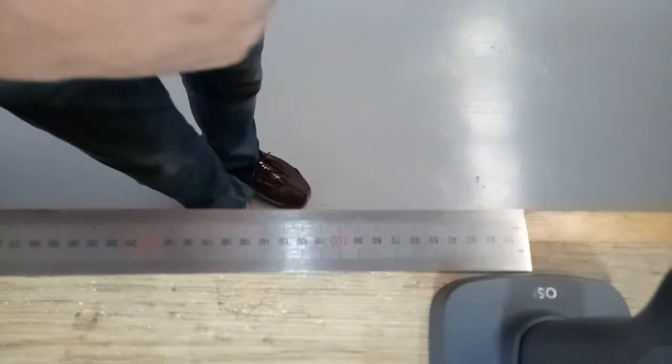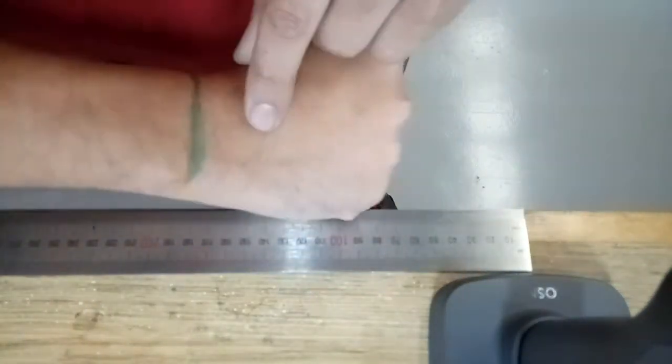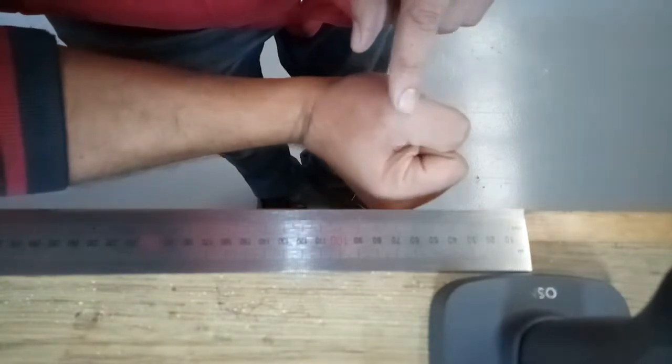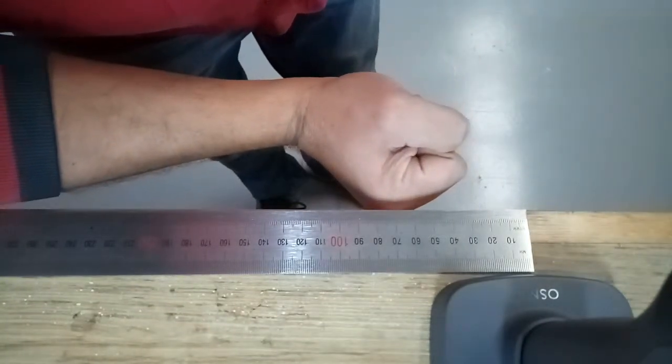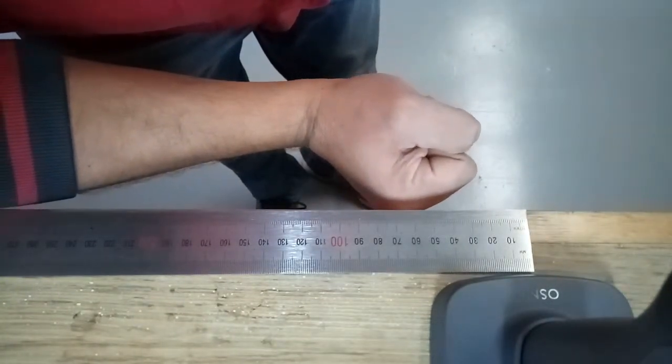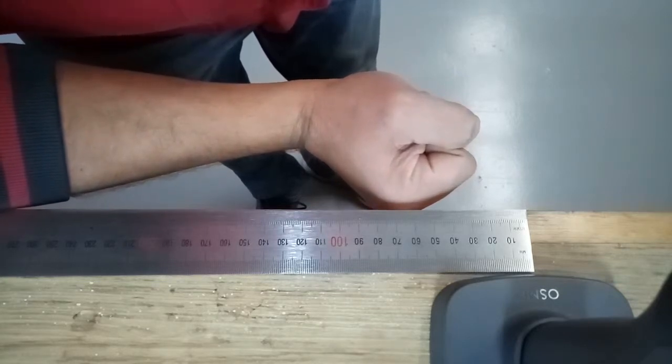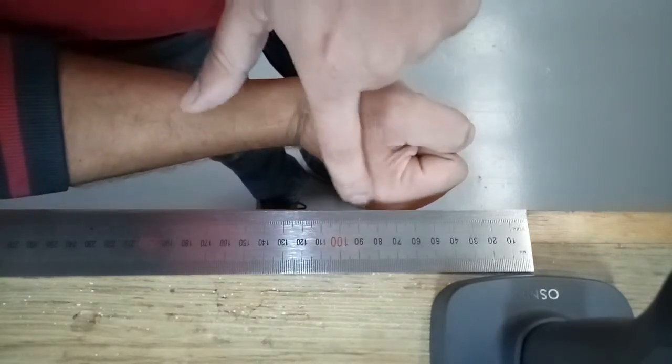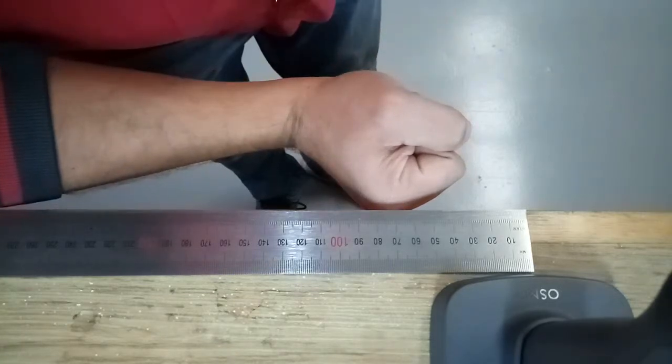The third photo required is of the affected hand on its side, deflecting in the upwards position. The wrist needs to be moved up as far as it can go, which will help us understand the angle of the 3D hand when the fingers are completely open.